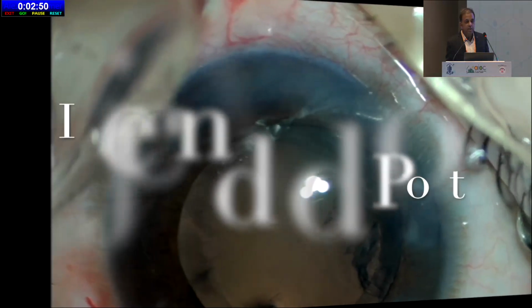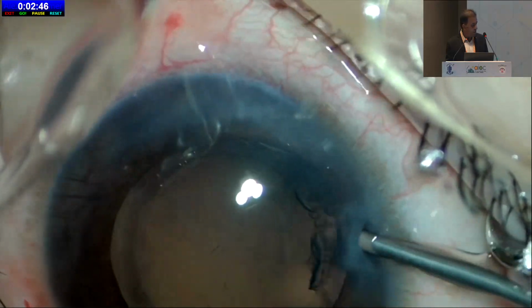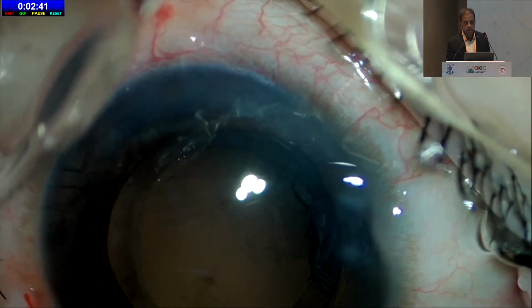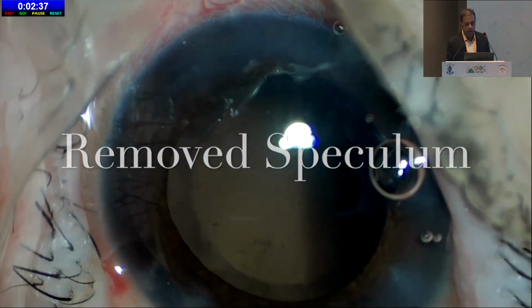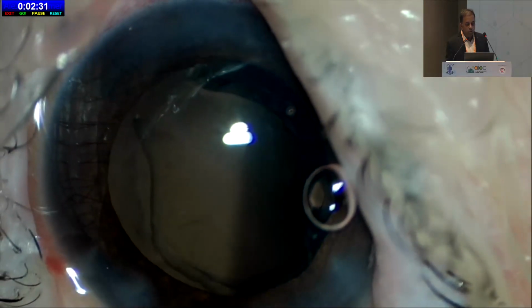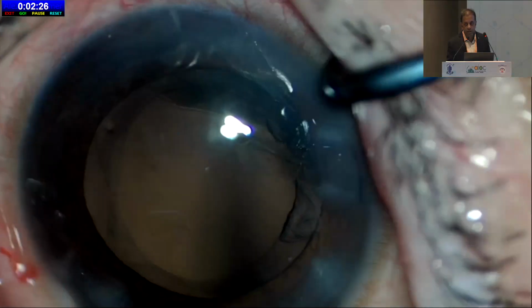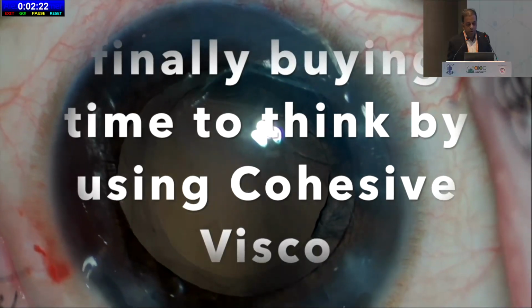I started planning in the back of my mind what to do. I initially injected viscoelastic from the main port and side port, but the PC was not ready to settle and go down, so I removed the speculum. I injected more high density viscoelastic from the main port to get more space inside the AC, so I could remove the remaining cortex and implant the IOL. The speculum was also changed.